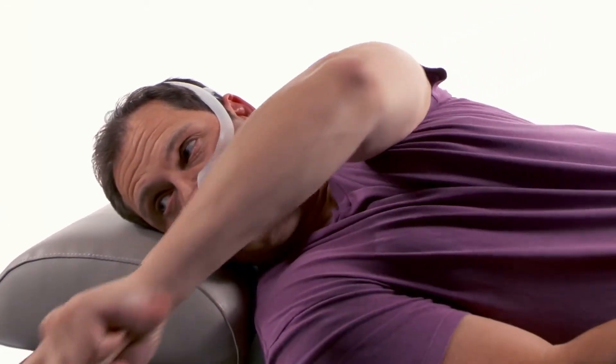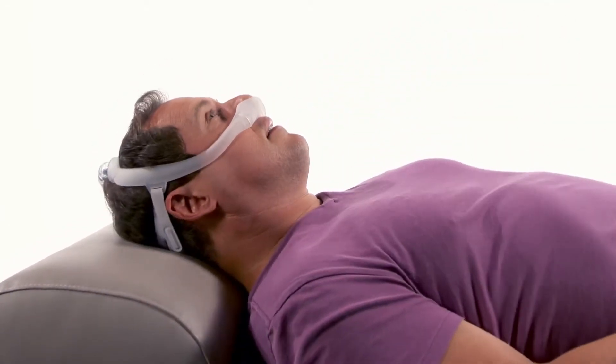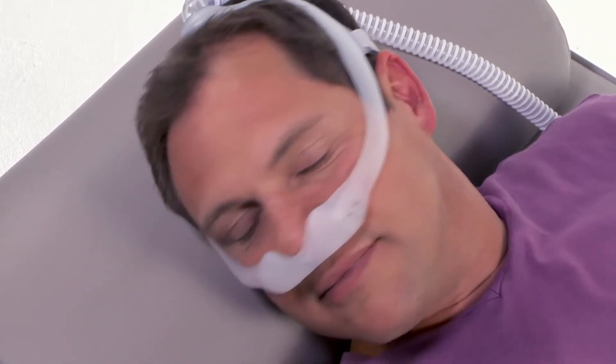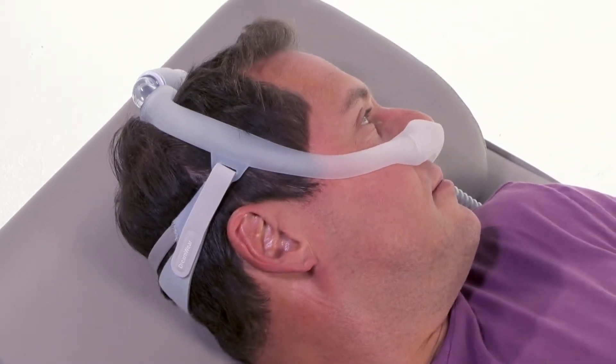Turn the CPAP device on and lie down for final adjustments. With your therapy at the prescribed level, breathe normally through your nose and turn your head from side to side to identify any leaks that may interfere with sleep.